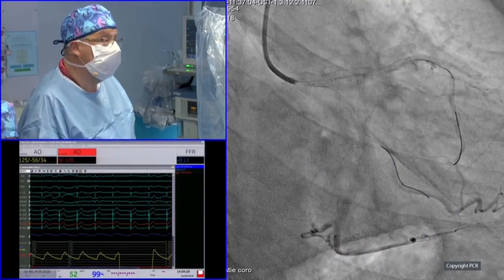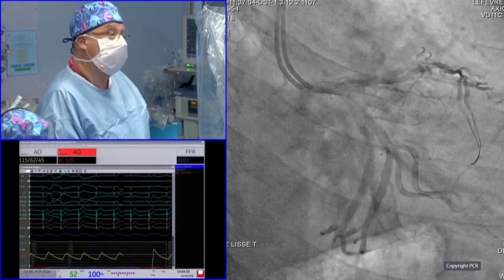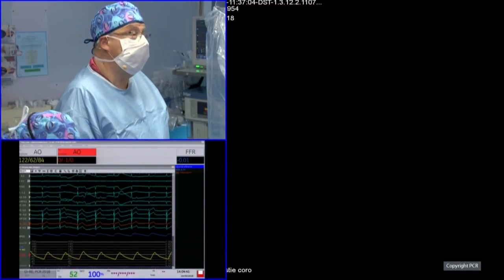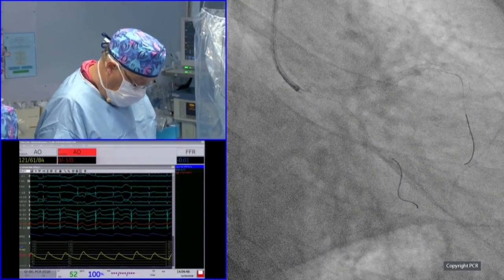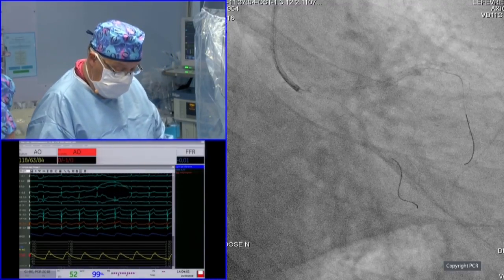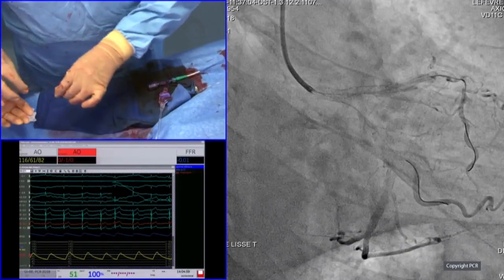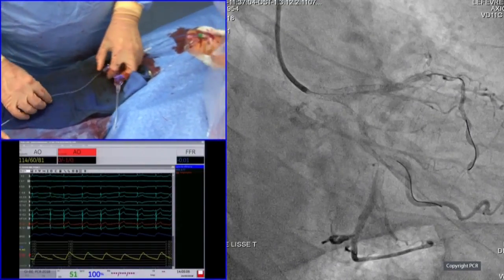Okay. Very clean and nice angio result. Yeah, so Bernard, what is your opinion? I think we should check with OFDI and we'll see if we need a final pot. Yeah. If I don't do imaging, my practice is usually to do a final pot. So you can see, maybe we can see again the last injection, but we have a very nice opening of the struts toward the circ without any lesion at the ostium. And we'll see it clearly by using the OFDI.